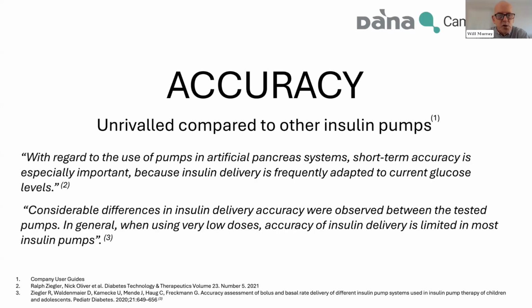And why is that important? I've just put up a couple of quotes from studies carried out by experts. If I can just let you read through those two statements. And I think the message is please don't assume that all pumps are the same, because they are quite different. If you're delivering a large dose of maybe 10 or 15 units of insulin, they're all pretty much the same. They're all as accurate as each other.